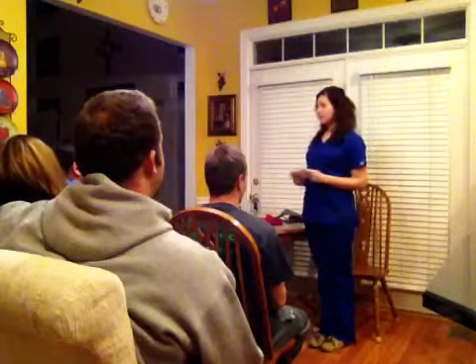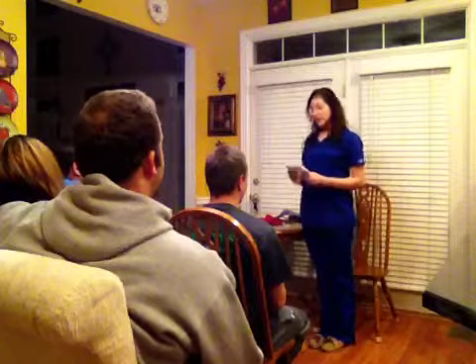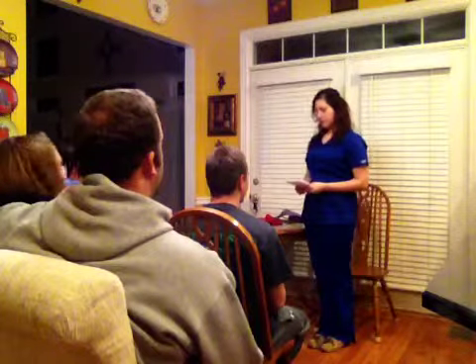Good evening. My name is Liz Wright, and today I will be demonstrating to you how to take a manual blood pressure. According to Dr. Peter N. Landless, author of the scholarly article, Hypertension, the Silent Killer, 50% of Americans who struggle with high blood pressure are on a medication therapy, and of those, only 30% have achieved ideal levels.